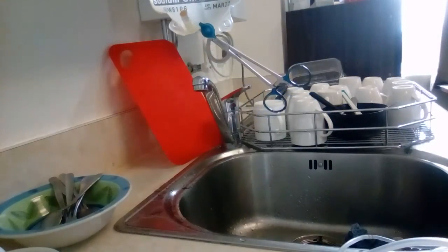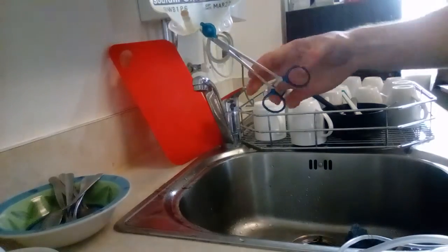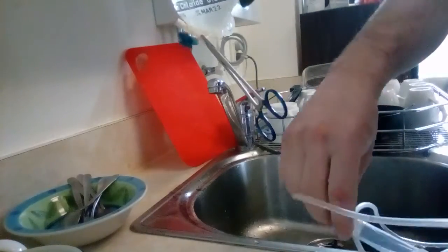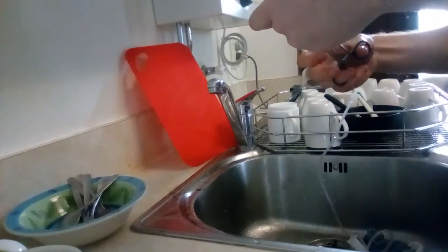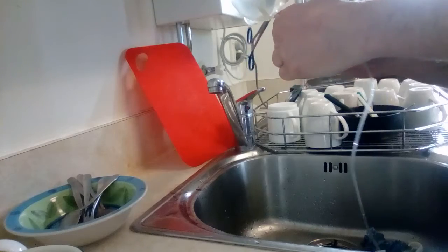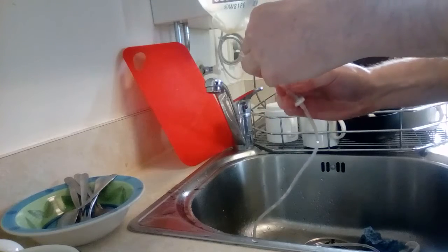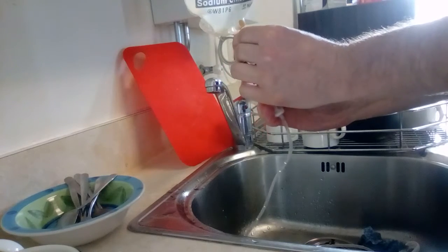Let's get started. There's a sterile end there. Close it off. There's a lot of things that are in the room.